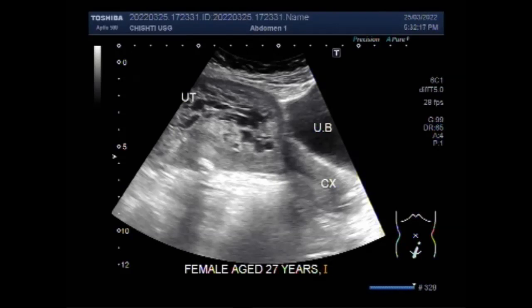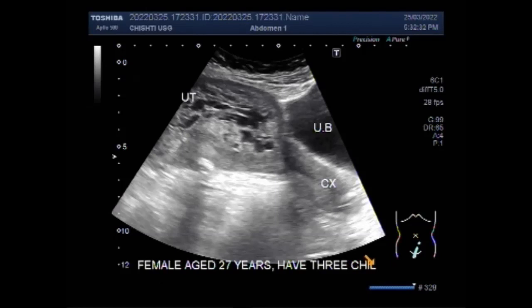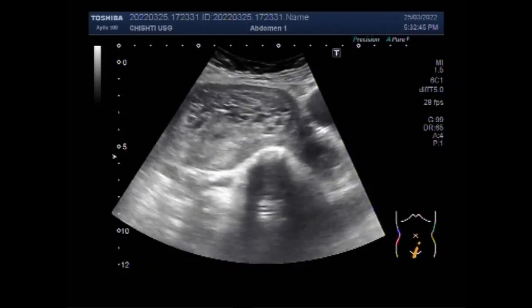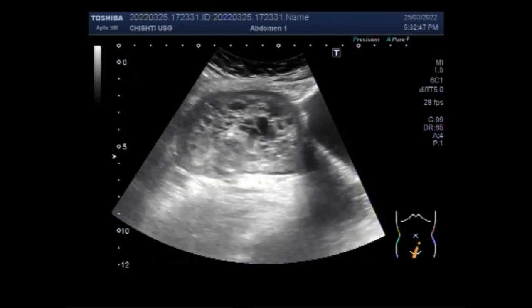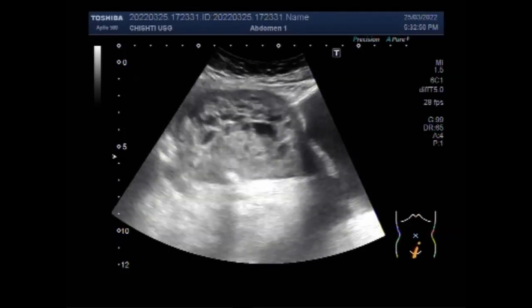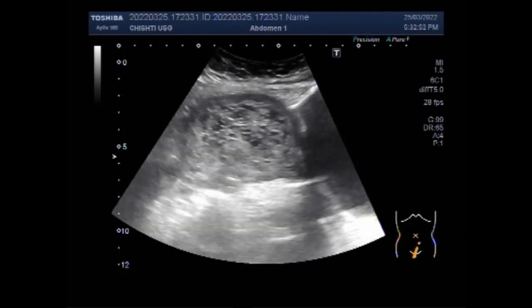Women appear to be pregnant but the uterus enlarges much more rapidly than in a normal pregnancy. Most women have severe nausea and vomiting, vaginal bleeding, and very high blood pressure. This female is aged about 27 years, has 3 children, and this is her 4th pregnancy. On ultrasound, it looks like a bunch of vesicles with interseptal fluids seen throughout the whole uterine cavity.